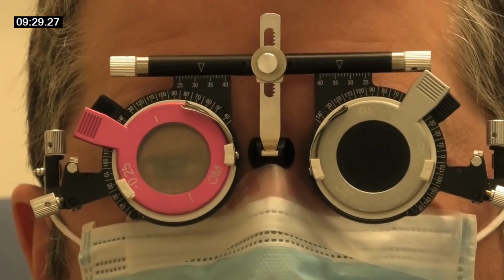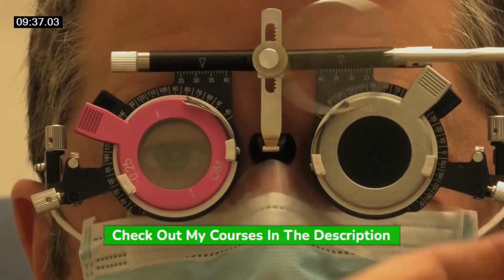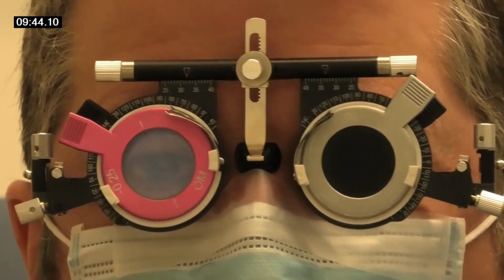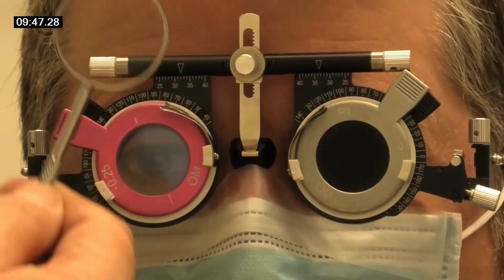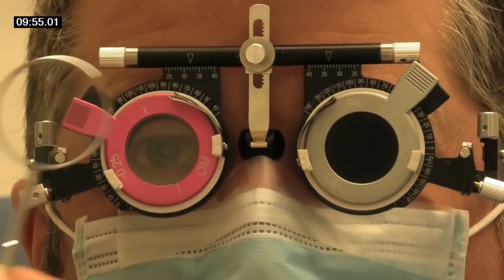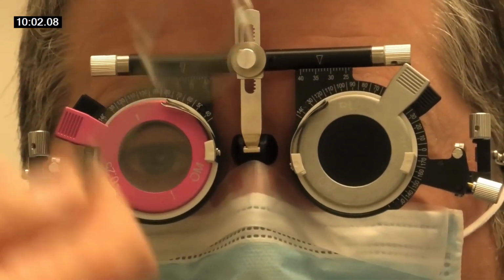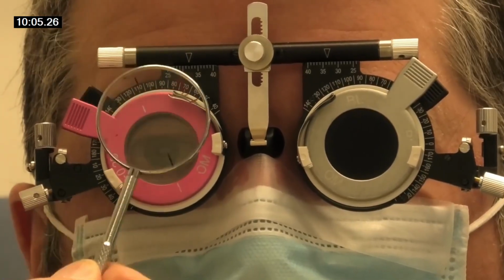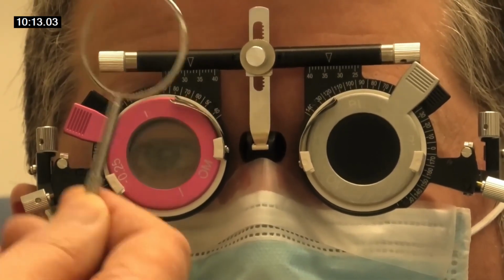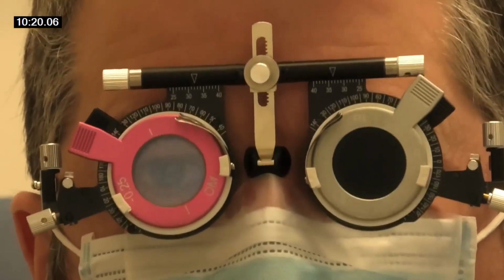So in this case, because he's got very good vision, we probably would do power first, rather than axis, because you might spend ages trying to find the axis, and there's no cylinder. Let me show you how, so you can practice in your own time. When you're doing this cross cylinder, the way to do it is: better first, better second, better first, better second. So you can see it's very quick like that. You have to practice it. It's very hard to do when you learn. He's seeing that side and that side. When I'm calling the names, better first, after I've turned, better second one. And he said second one. So that goes out.